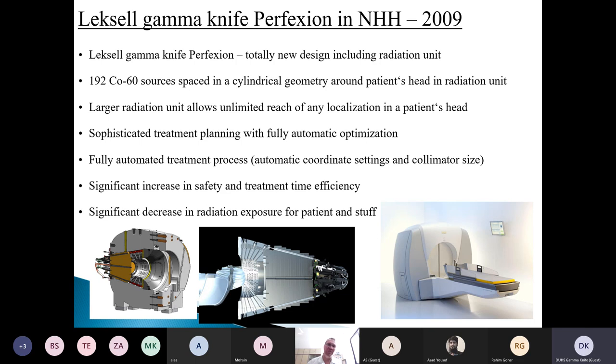So in fact, if you don't need to change the patient's head position, where we can have the patient treated in 3 different angles, horizontal, chin down, chin up, it can be a single push of the start button, and it can take 10 minutes, 1 hour, easily 3 hours, and the system is 100% taking care of the treatment. Of course, there must be personnel watching the patient, talking to the patient if needed, and able to interrupt in the case of any medical issue.